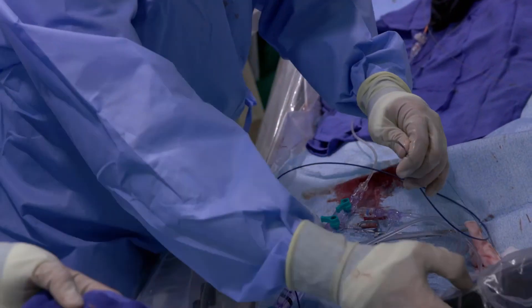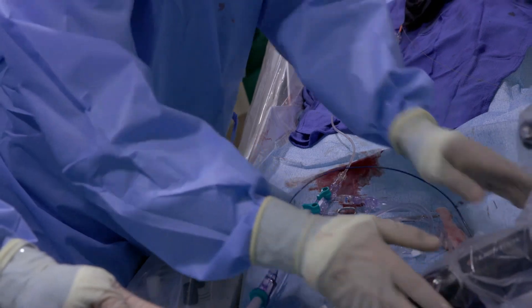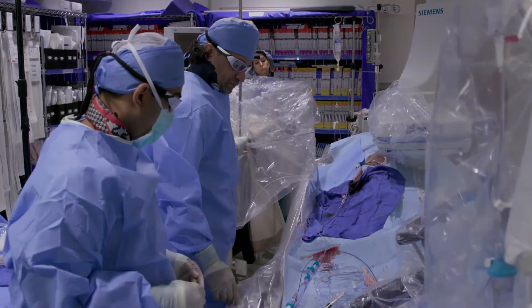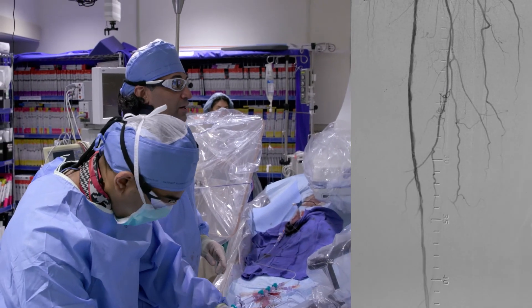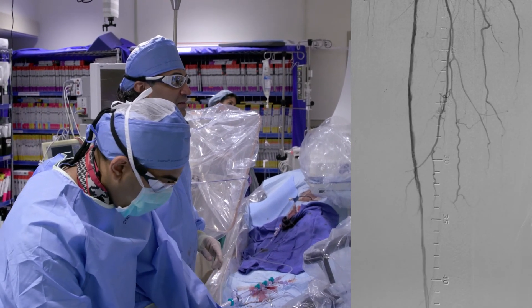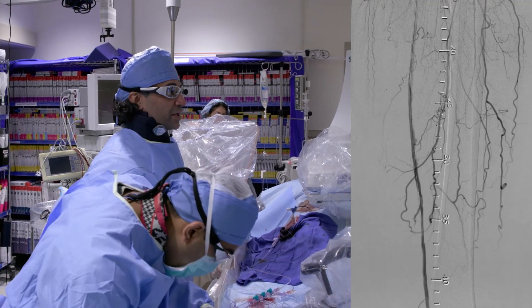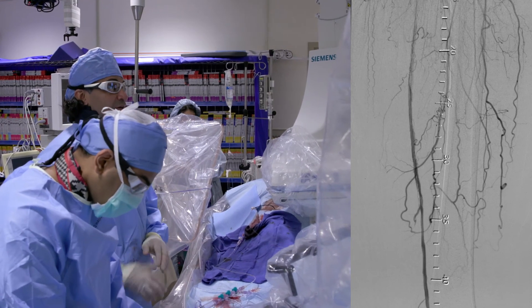You can see our plaque. So let's go ahead and do an angiogram and see what we're looking at. Our distal cap was around 24, 25, and then we had disease all the way down to about 37 to 40. So we did great atherectomy there.